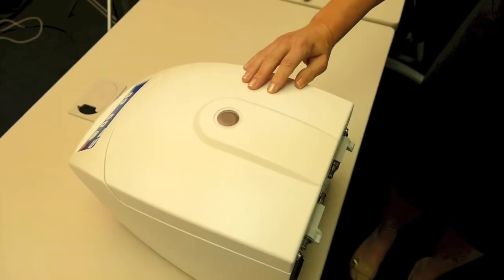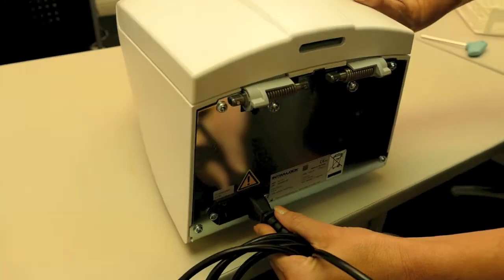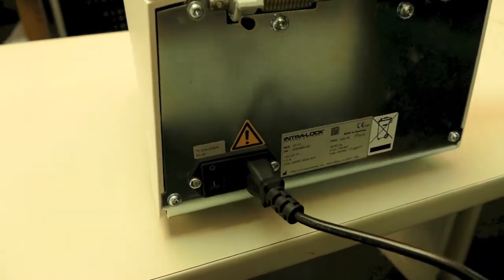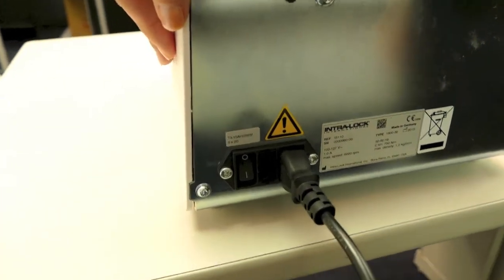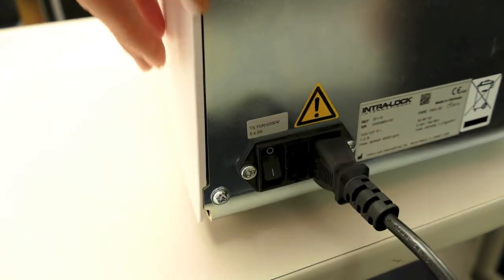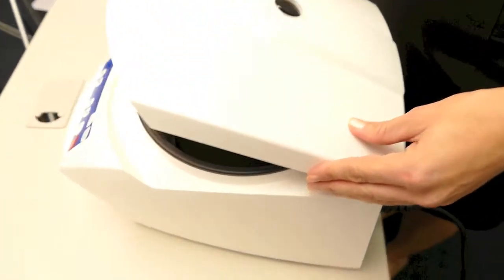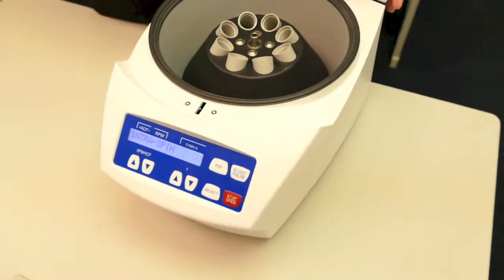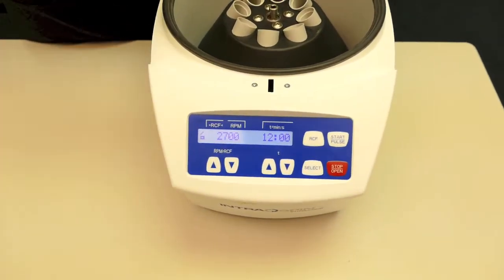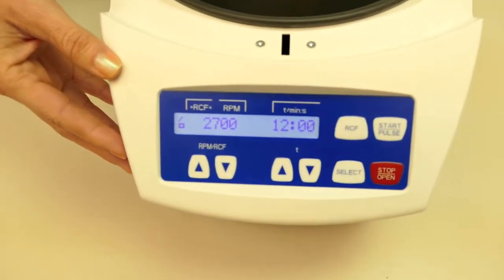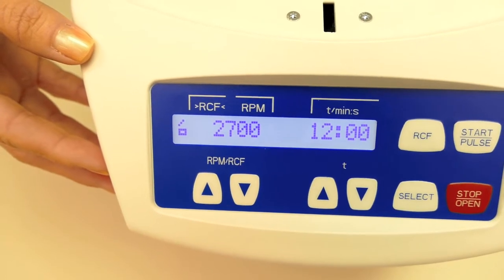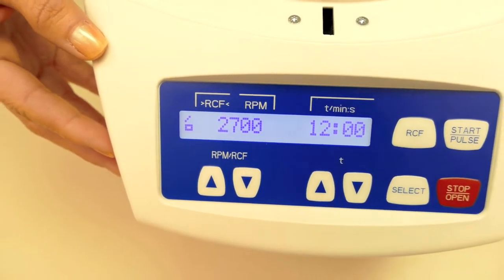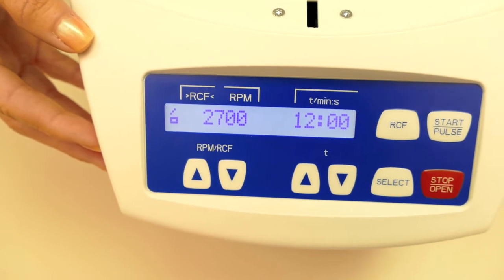Now let's review the IntraSpin centrifuge. We're going to insert the power cord and plug the unit in. The on-off switch is located to the left of the power cord. I'm going to turn that on, and the machine will open with power. Please note it is set for the LPRF protocol at 2700 RPMs and 12 minutes. Please consult your manual for more details regarding the display control settings.